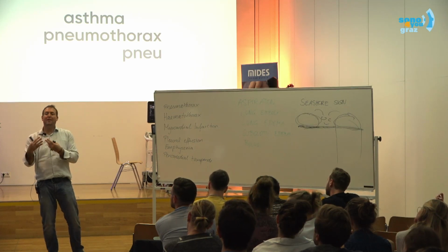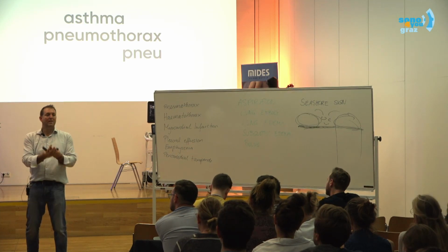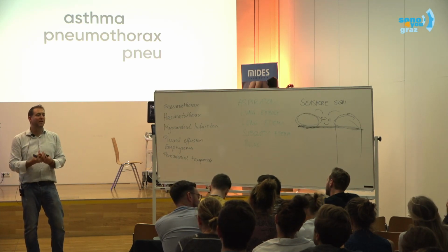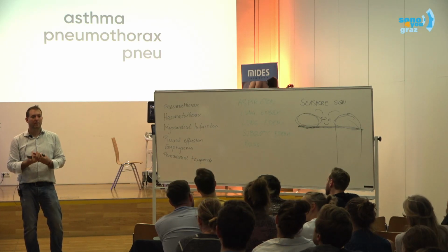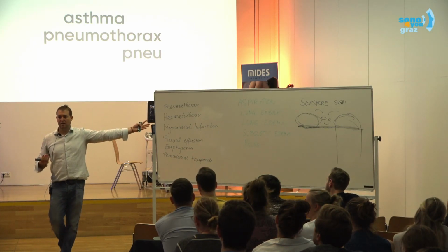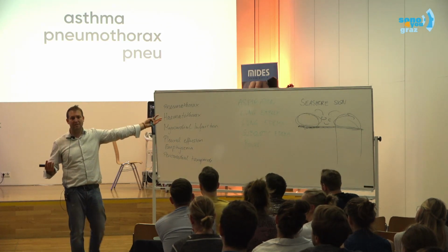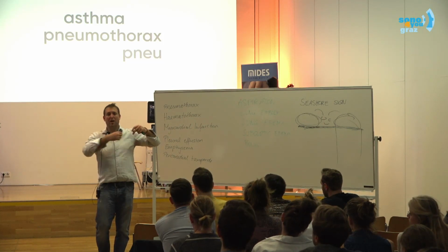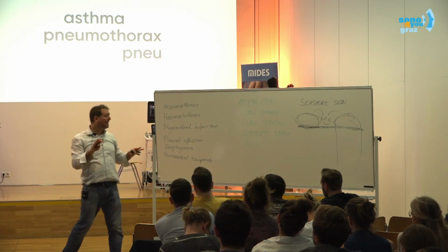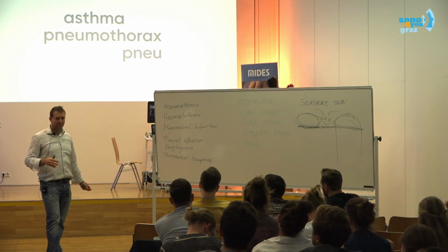So what pattern do we expect with someone with even massive pulmonary embolism? Will there be sliding? Yes. Will there be A lines, B lines? A lines, yeah. Again, he can die with a sonographically completely perfect pattern like this, right?